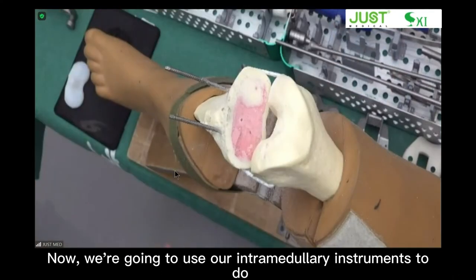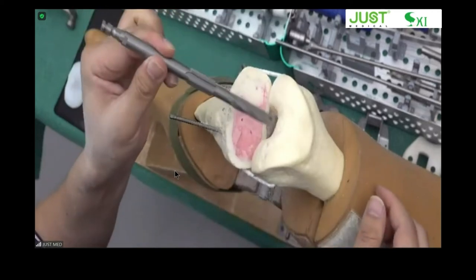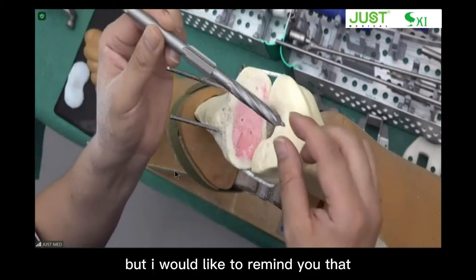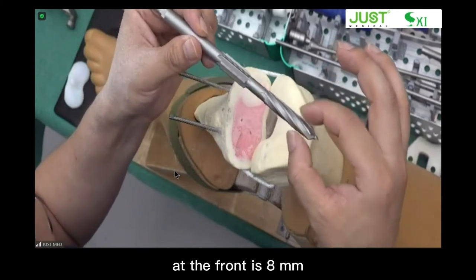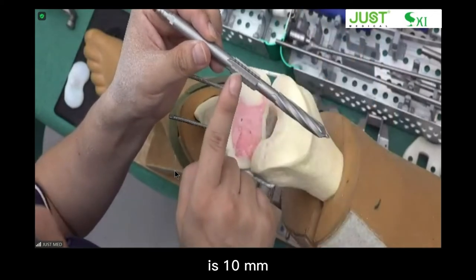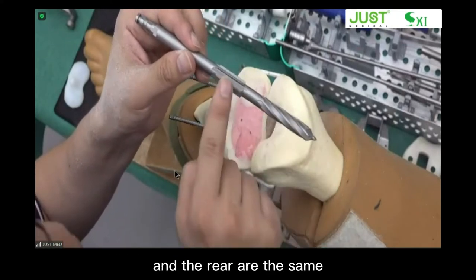Now we're going to use our intramedullary instruments to do the distal femur cuts. We use a step drill to penetrate the femoral canal, and use it as a device to determine its position. But I would like to remind you that the diameter of this step drill at the front is 8 millimeter, at the rear is 10 millimeter. Different diameter. Here is a bigger hole. For other manufacturers, maybe the diameter from the front and the rear are the same.